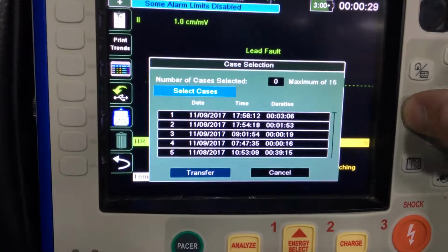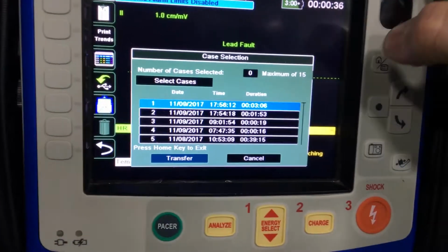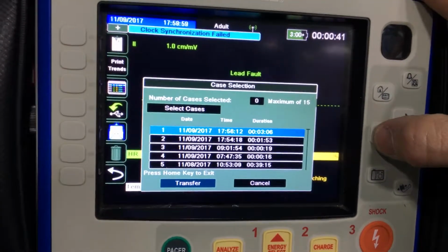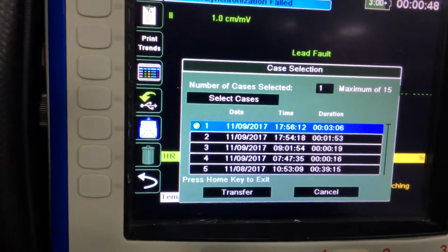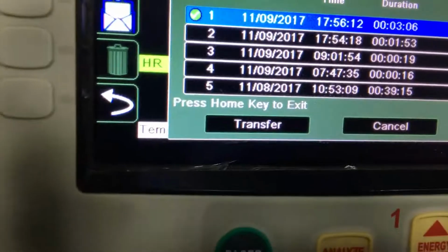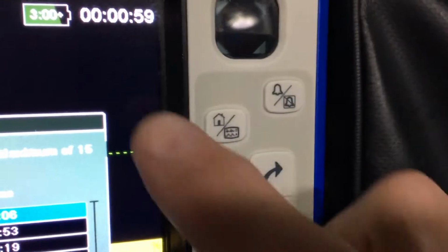So you're going to hit select case, and then you can just tab down. The other day I found over 100 of them, so it should be the very first one after you've closed it. It's going to be the one you just got done with. Hit this button here, and it will be a green check mark. So right down here it says press home key to exit after you've done that. This is your home key, so you hit it.